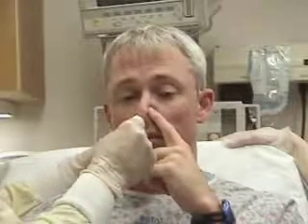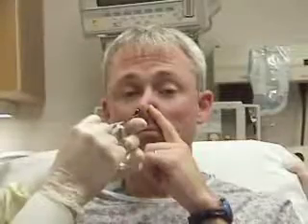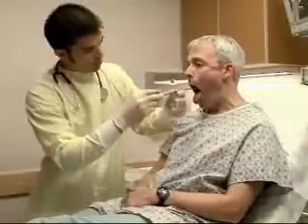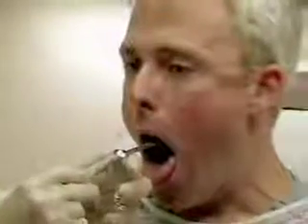Have the patient breathe in through each nostril to assess which side is more patent. Premedicate the nasal cavity with a vasoconstricting spray such as phenylephrine or oxymetazoline. Anesthetize the nasal cavity with a topical anesthetic such as 4% lidocaine or topical lidocaine jelly. The posterior oropharynx should also be anesthetized with lidocaine or topical benzocaine spray. Nebulized lidocaine may also be used.